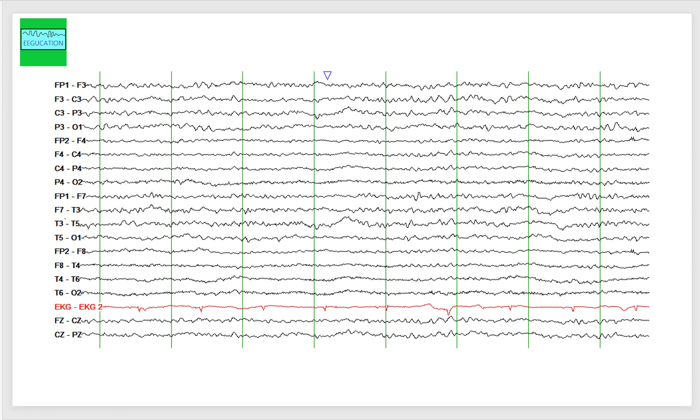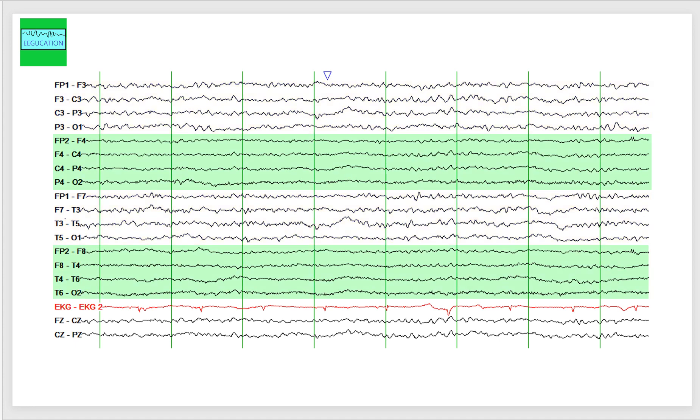What you see here is an asymmetry between the left hemisphere and the right hemisphere. Channels that end with an odd number are recording from the left hemisphere and channels that end with the even number are recording from the right hemisphere. Channels that end with the letter Z are recording from the midline.